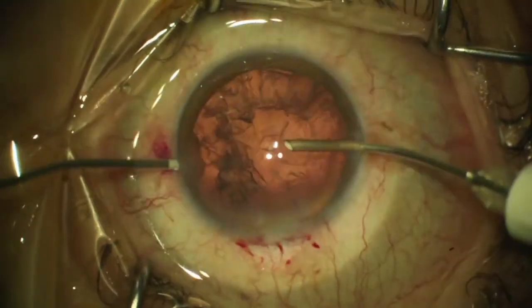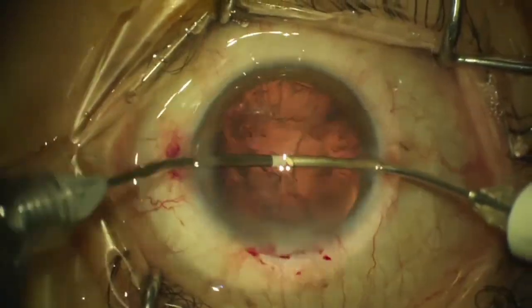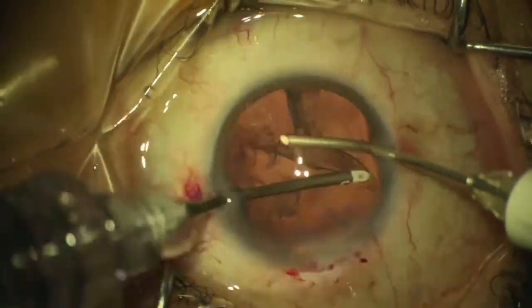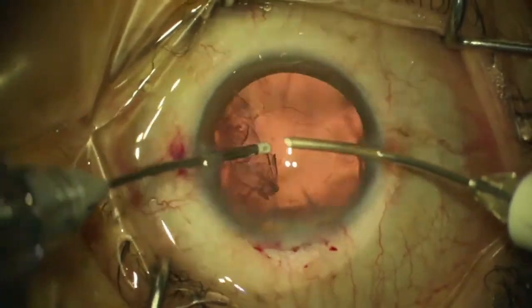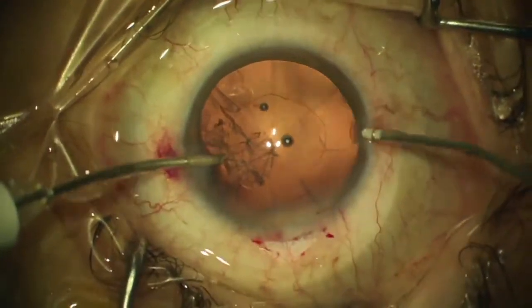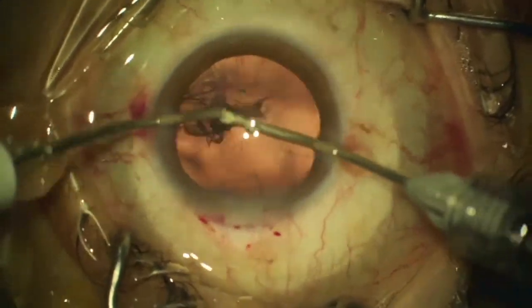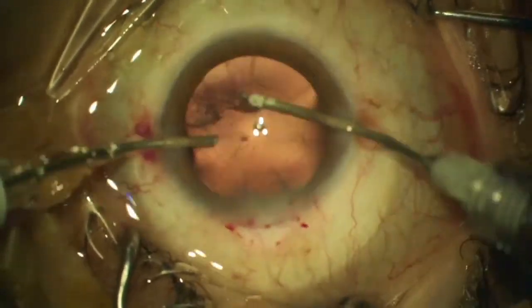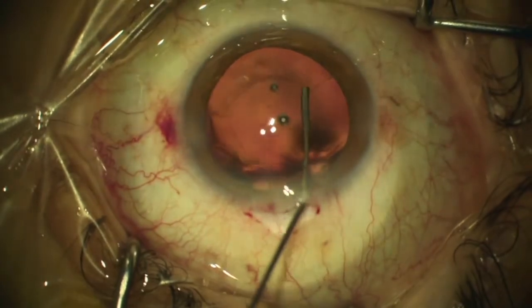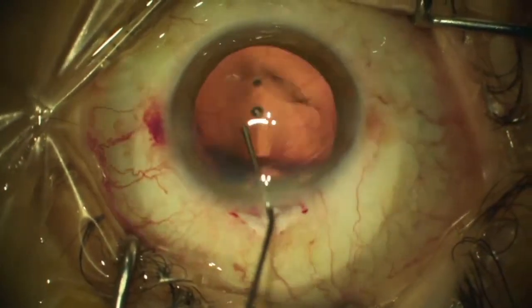Once the nucleus is emulsified and removed, the cortex is aspirated and the capsular bag is cleaned up. The bimanual tips ensure 360-degree access. The aspiration device has a soft polypropylene tip which prevents tearing the capsule when it is aspirated accidentally.